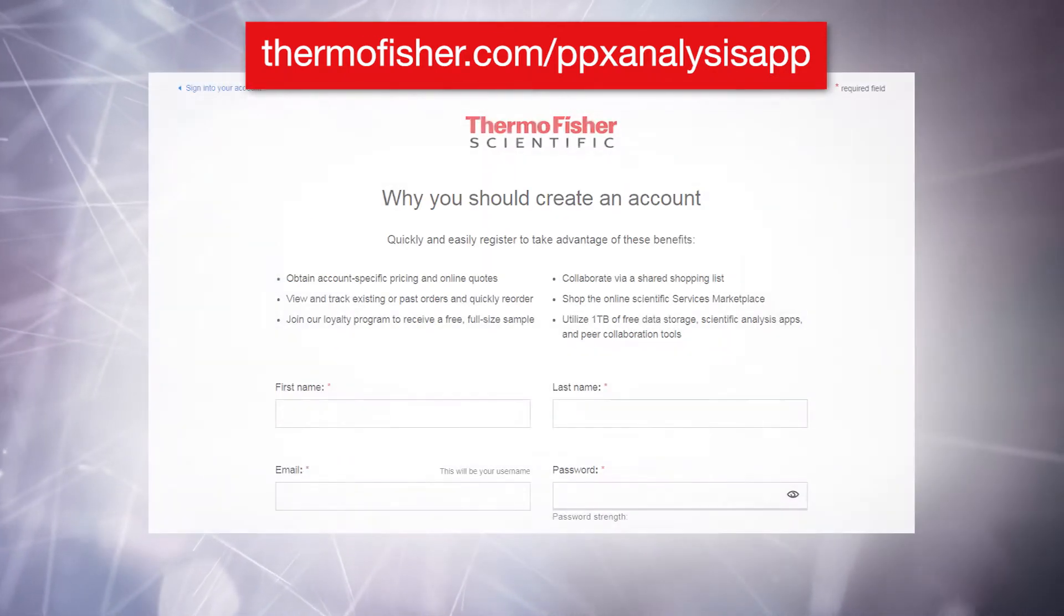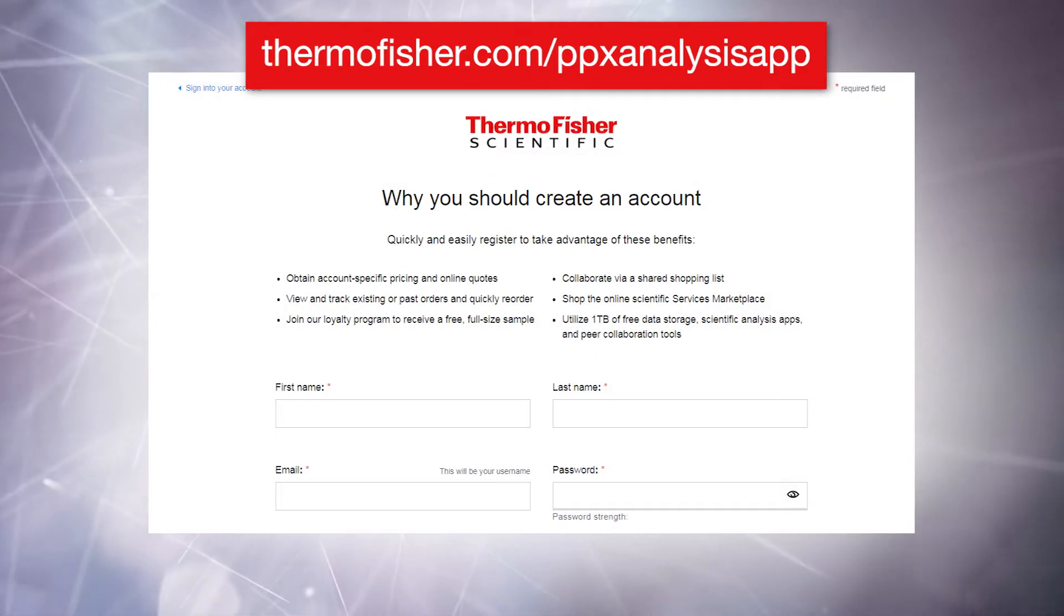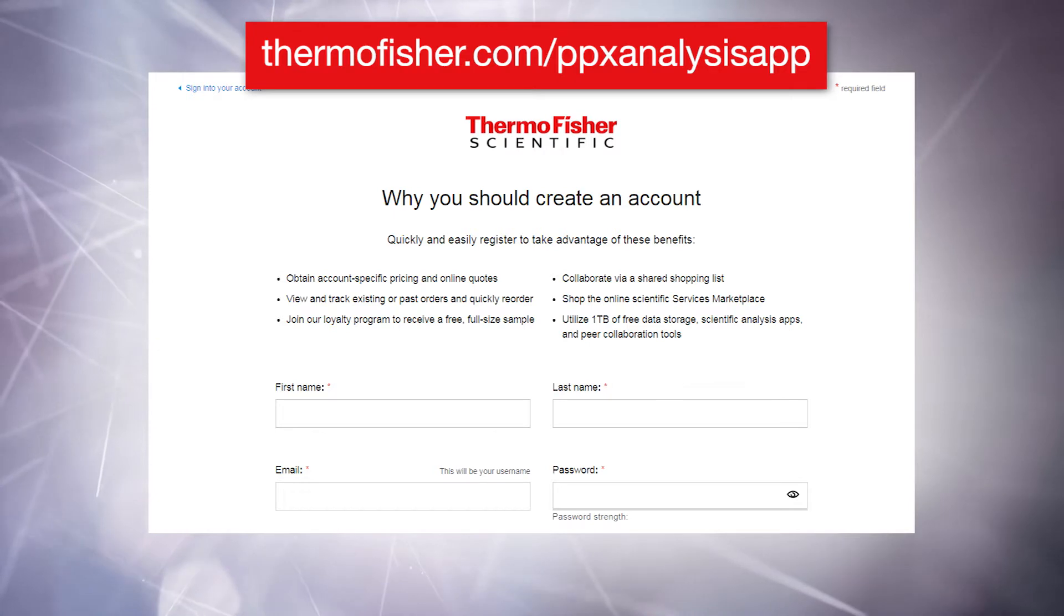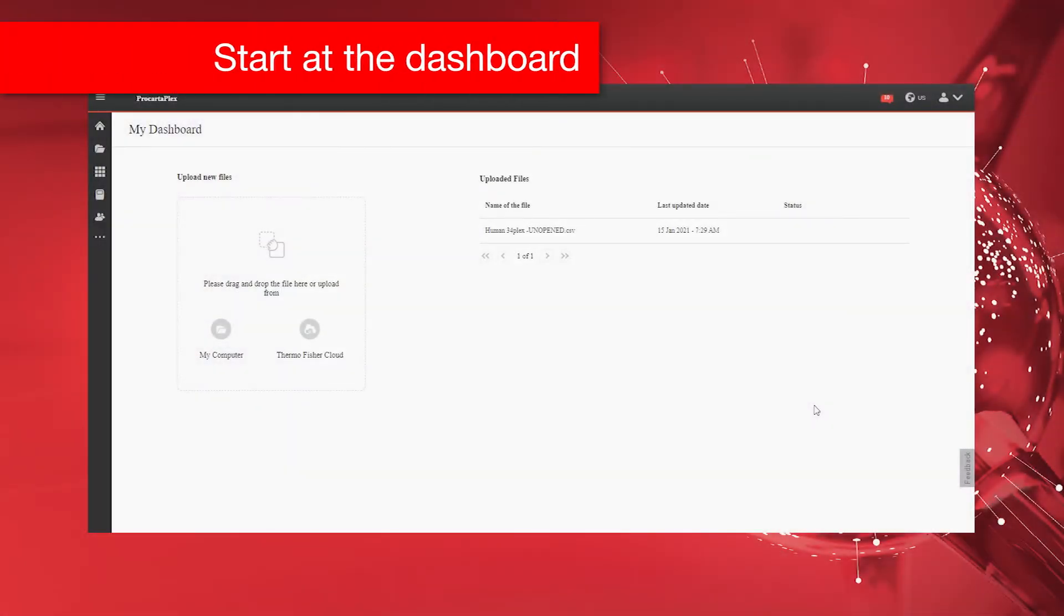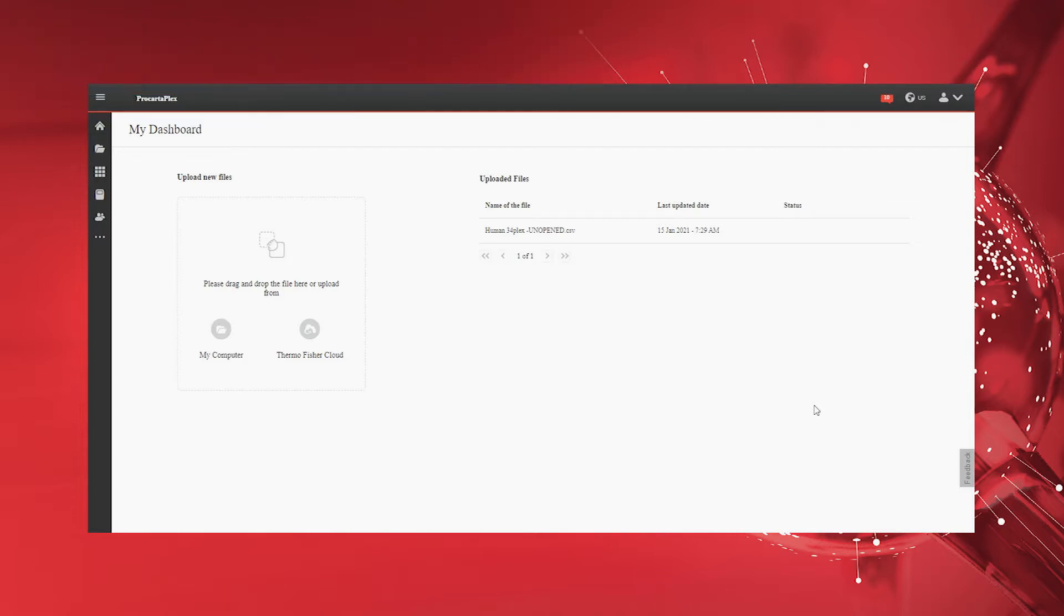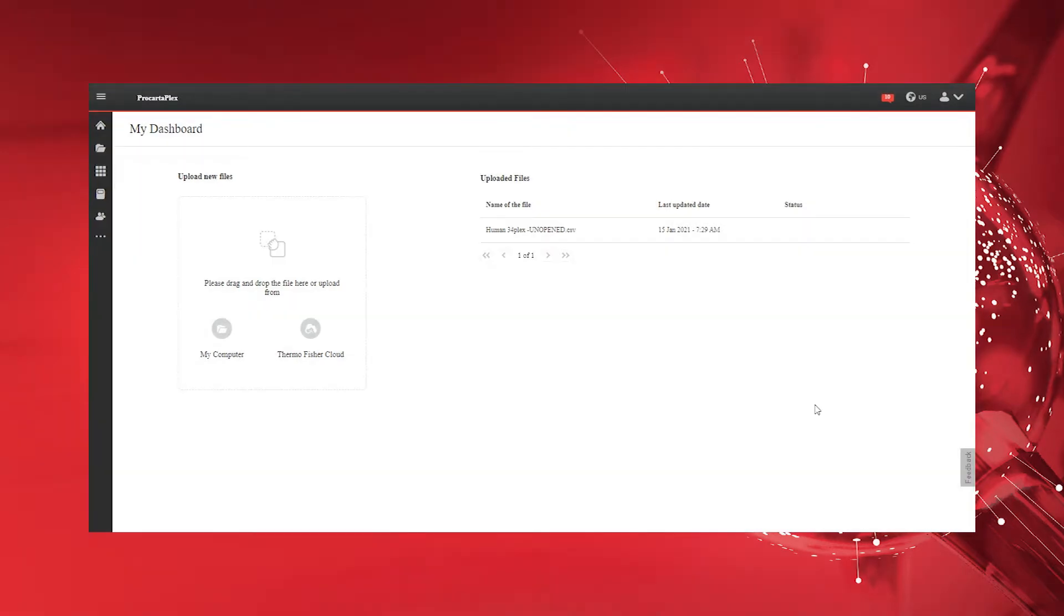Log in using your ThermoFisher.com account to access the dashboard page. The dashboard page supports the import of CSV raw data files generated by Luminex instruments, including Luminex Exponent and Luminex IntelliFlex, or the BioRad BioPlex software. After successful import, click the raw data file to be analyzed to proceed to the plate setup page.